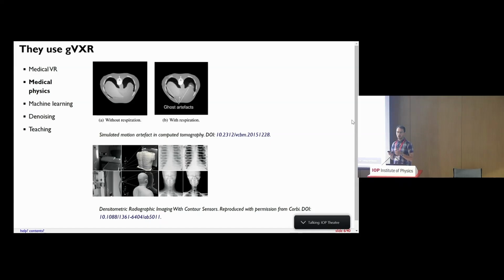So he thought, like, what if we use gVirtualXray to simulate this second energy using a Kinect to reconstruct the surface of the patient? So here is the single energy, and here this is combining the two radiographs, the simulated one with the real one. And, well, you can see if the contrast is better on the right-hand side or on the left-hand side.